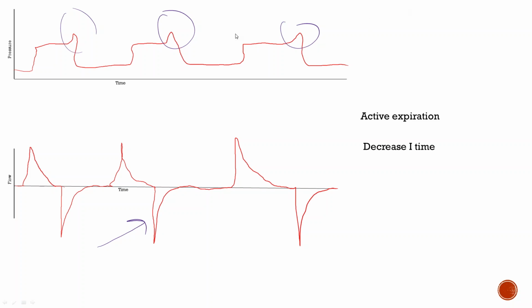Okay. Yeah, so you want to get rid of this part of the curve. It's just too much, too long. It's the opposite of what we're used to seeing because usually our patients want more because of our low tidal volumes, but this may be present later in the hospital stay at some point. We just never see them because we send them to the floor.